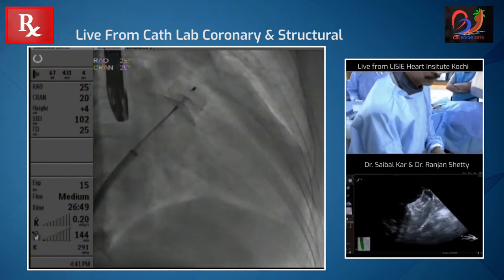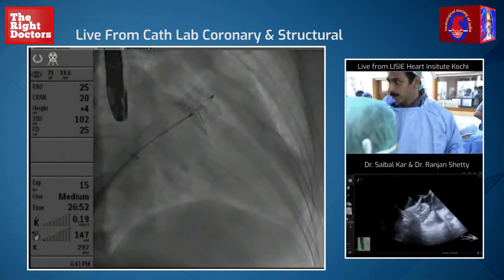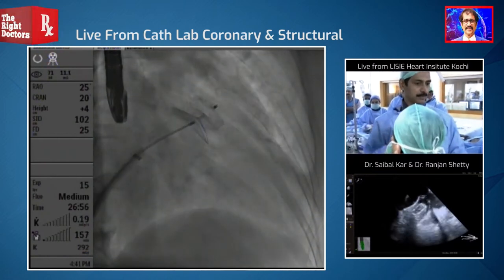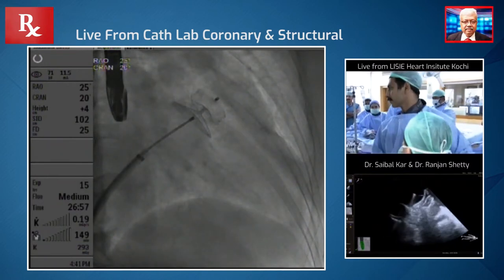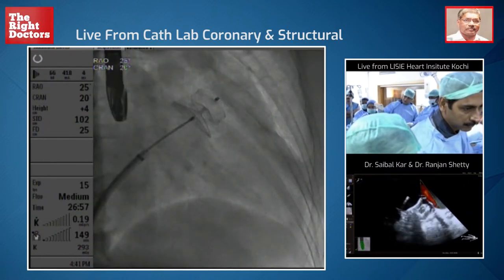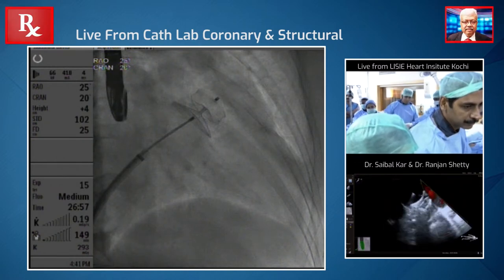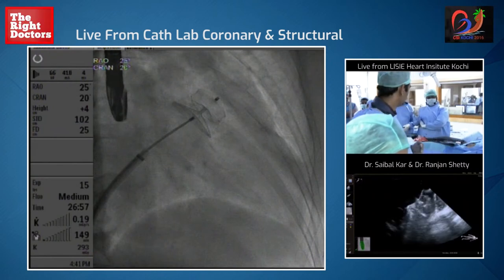I can just do a gentle separation here. And you see the lobe is staying where it is? That looks great. Let's do zero degree and then colour flow. The size also is a perfect size — it's covering. Probably there's no colour flow. What you see there is the pulmonary veins, and in the appendage there's absolutely no colour flow.